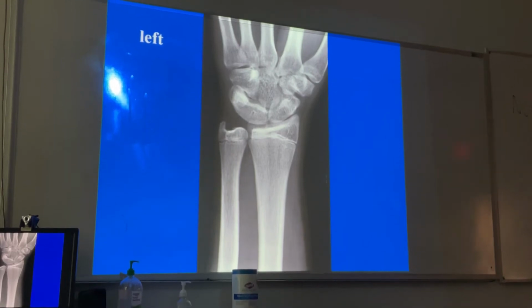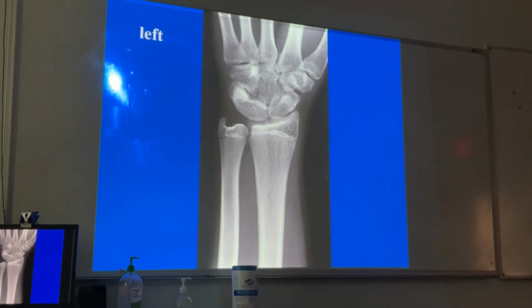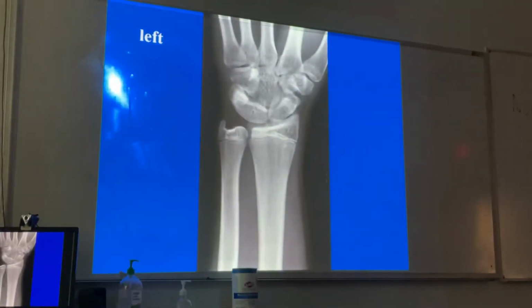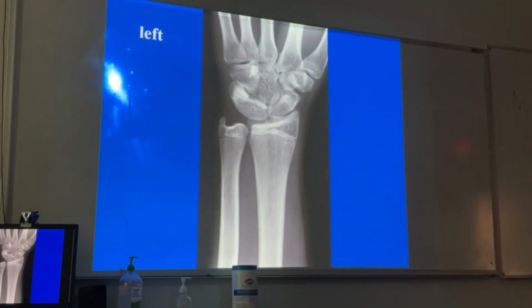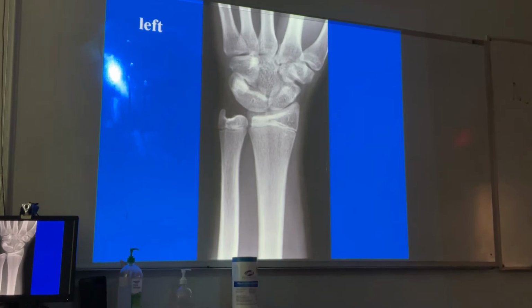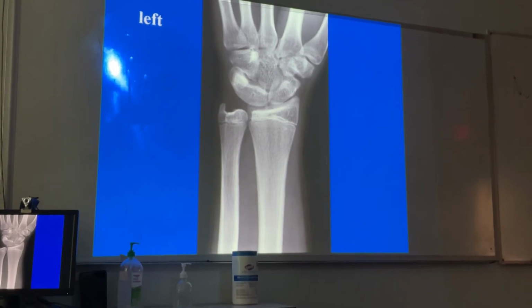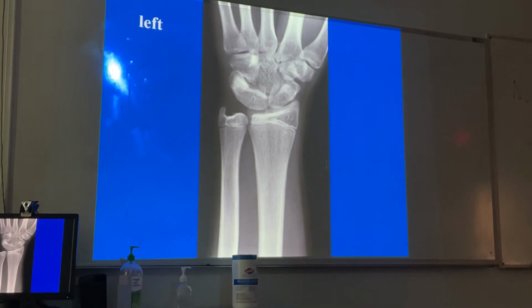Right. Okay? They complain of hand pain. I've done conservative care. I can't do anything else. What do you suggest? Okay? I think that's how the radiology game is played. Okay? Just to say, well, you've got carpal coalition, it doesn't matter. It depends on who has it. If this is a left-handed guitar player, would that make a difference?